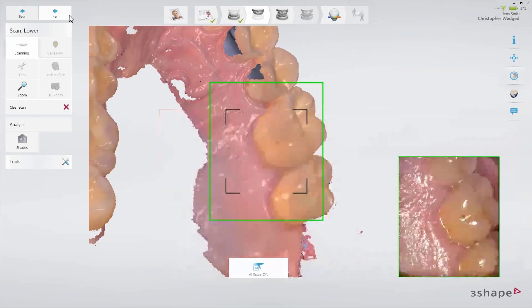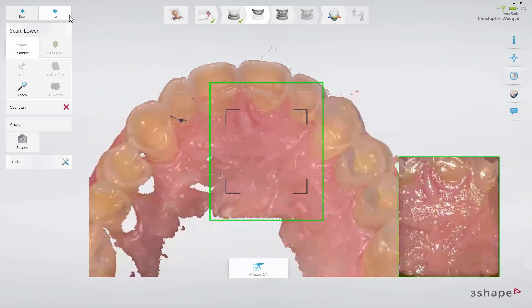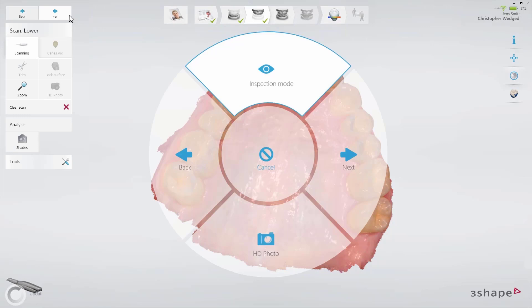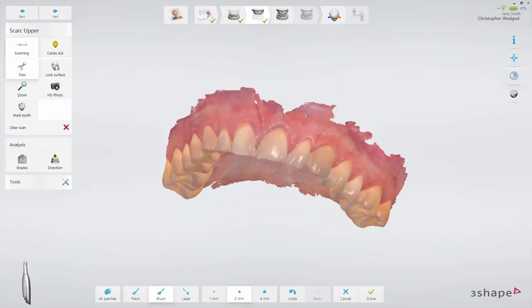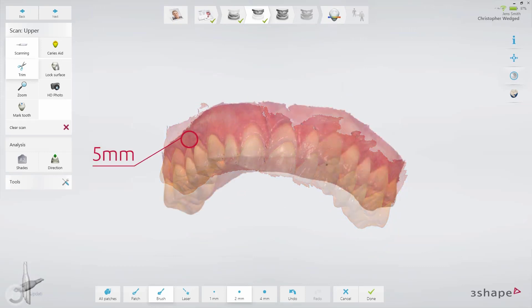Then move to the palatal side going along the whole arch. Scan palatal starting from the incisors and slowly go from side to side across the palate in the distal direction. Inspect the scan when completed and make sure to capture at least 5mm of additional space between the margin line and the soft tissue.